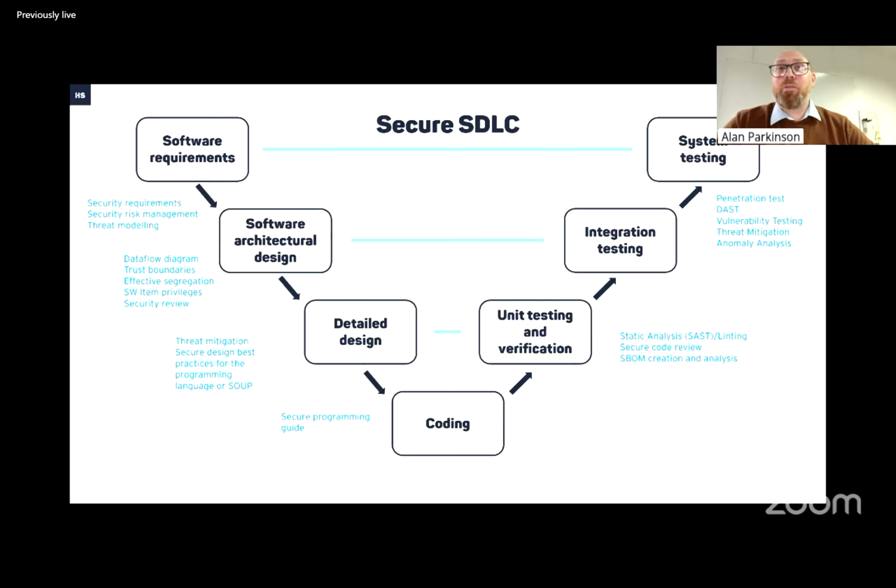You've got to show all your traceability for your threat modeling, just like any safety risk. Your threat modeling and your security risk assessment is just like safety. You need to show traceability throughout. And then you might have some anomalies left over. These would hopefully be quite low, and you would need to analyze and have a justification for leaving them there.